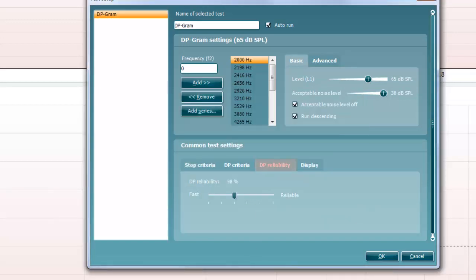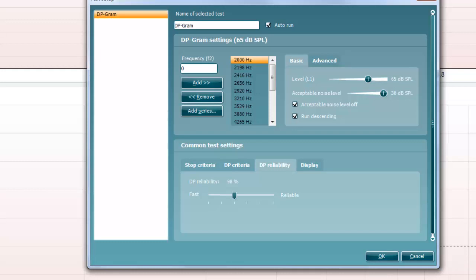The DP reliability tab indicates and allows you to set how reliable the DP measurement must be in order to allow the system to accept the measurement as a true DP OAE. Basically, the OAE is compared to the noise surrounding it and the reliability represents the chance that the OAE is indeed not part of the noise.